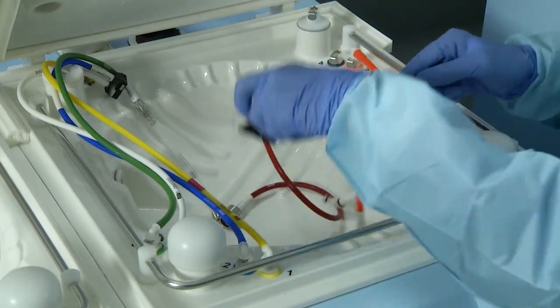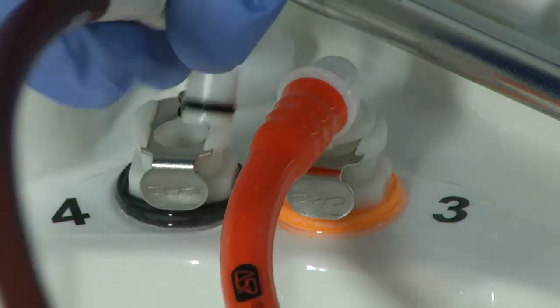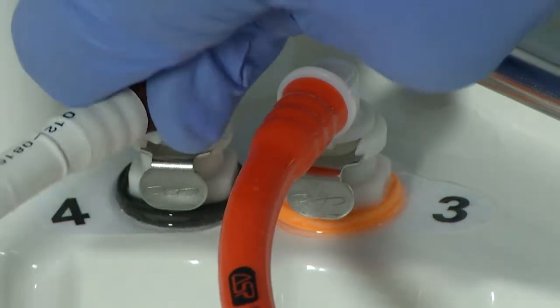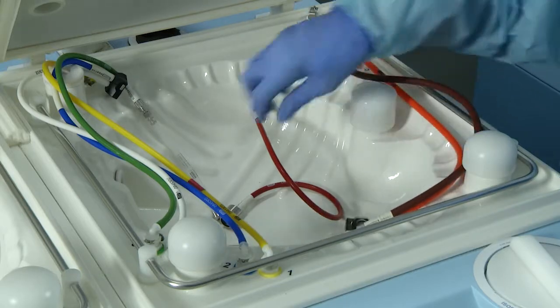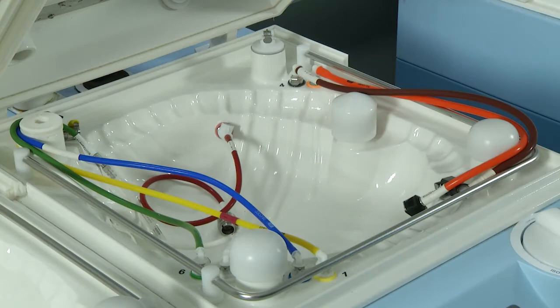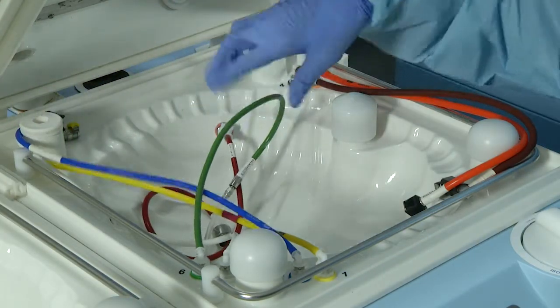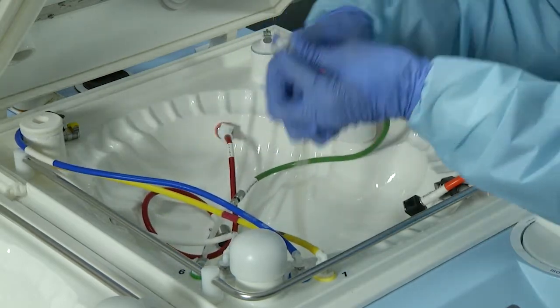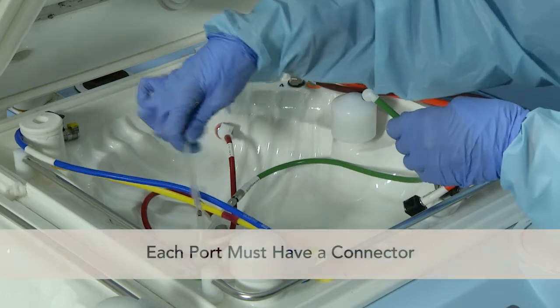The brown connector will fit into the black port. To run a cycle, all 6 basin ports must have a connector in place. When a diagram does not indicate that a colored connector is needed, a clear connector will be required to connect the scope to the basin.